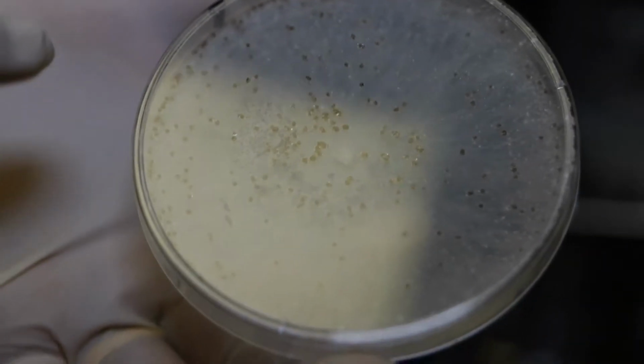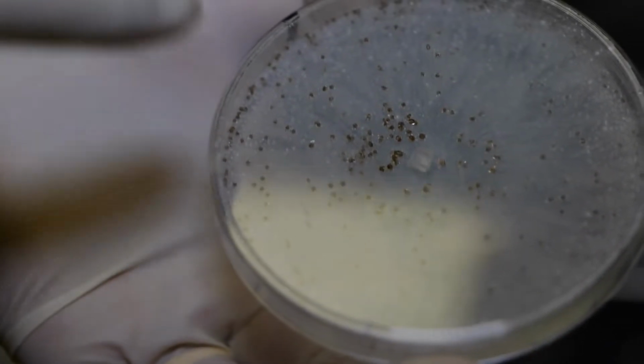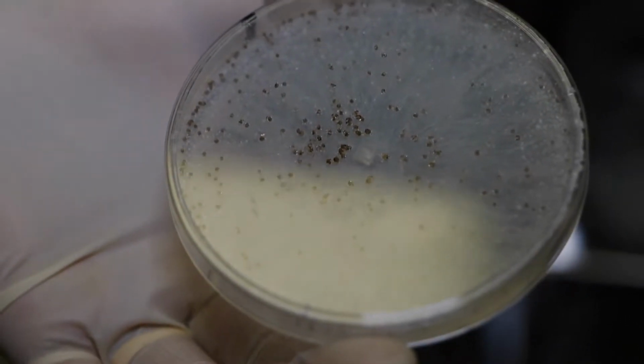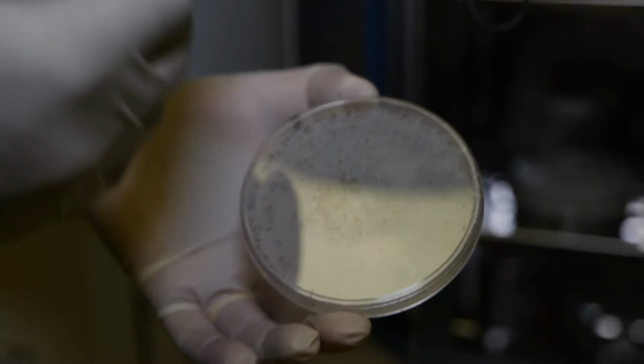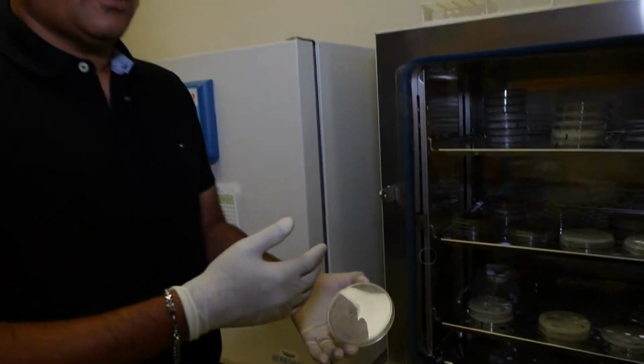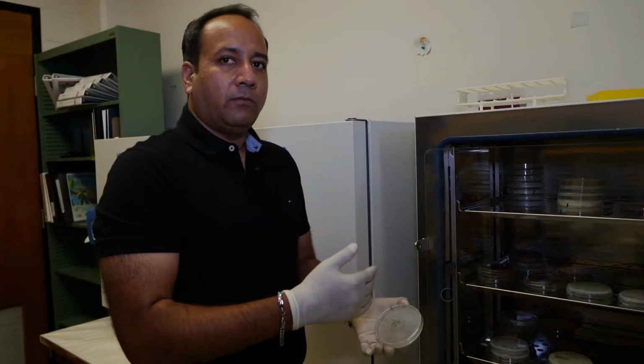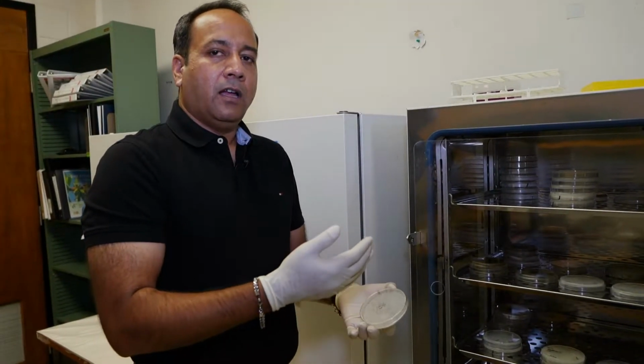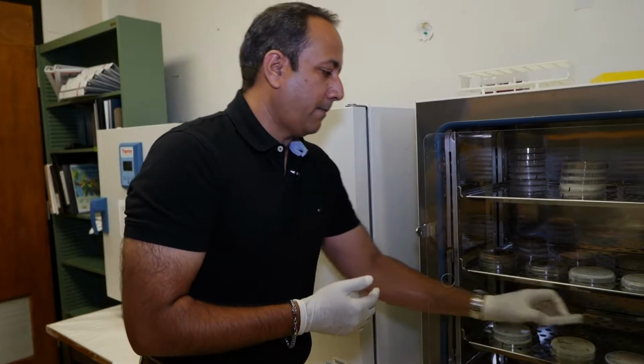Once we see this, we are about 80% sure that this is southern blight. Again, we have to make sure what species. There are different species of the same genus, so we have to figure out based on a molecular test like DNA sequencing what that particular species is.